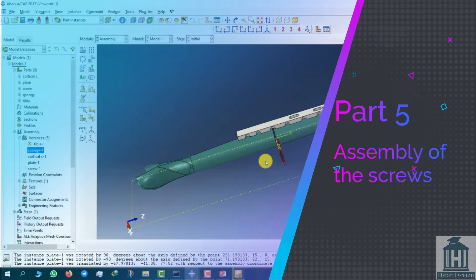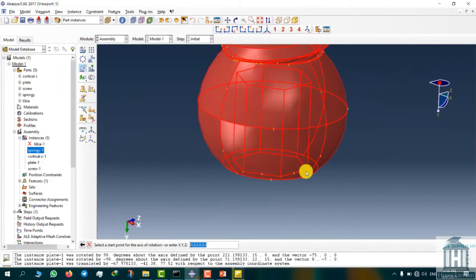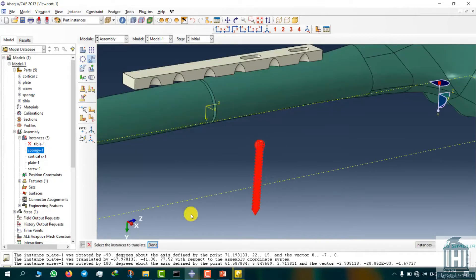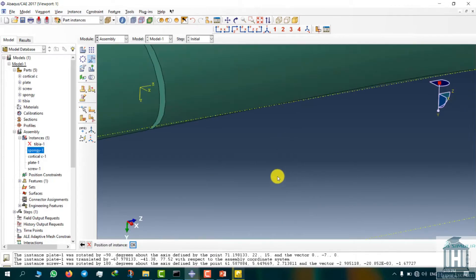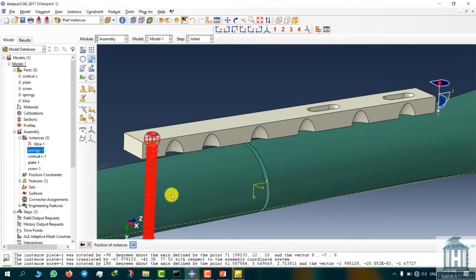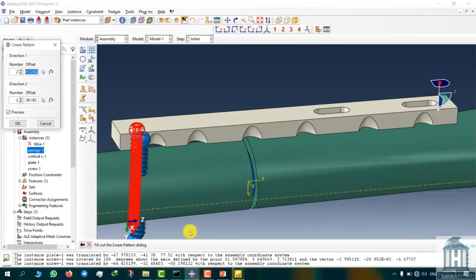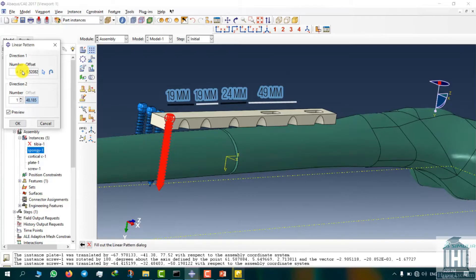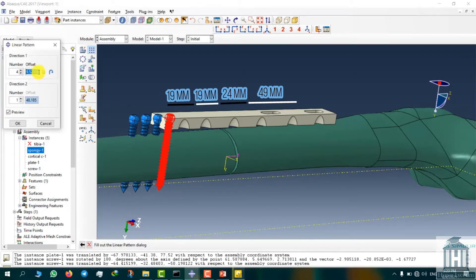It is time to add the screws to our model. First insert the screw part and then rotate it 180 degrees so it will match our model. Transfer the screw to the first thread hole on the plate. We are going to need five screws in total. Use the linear pattern tool to add them to the model. The first three screws are located at 19mm distance from each other in the z-direction, and the next two are at 24mm from the third screw and 49mm from the fourth screw.